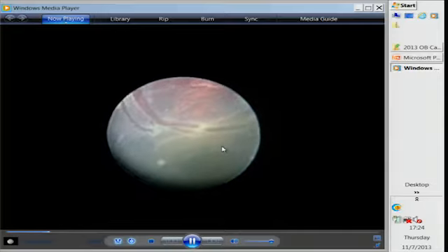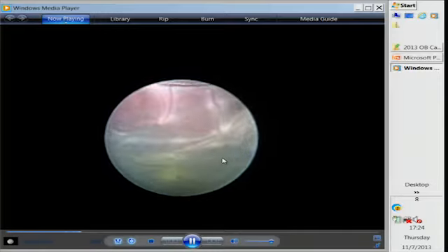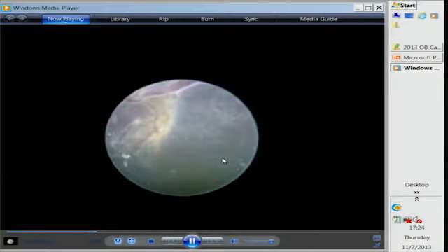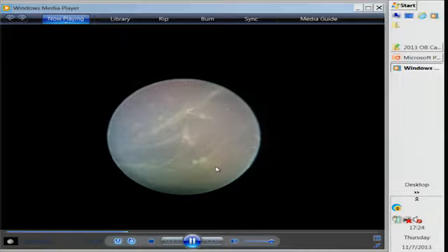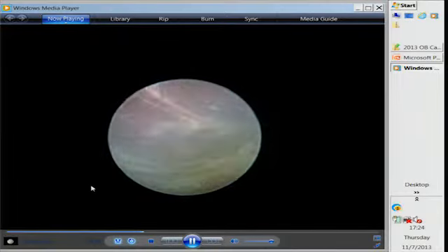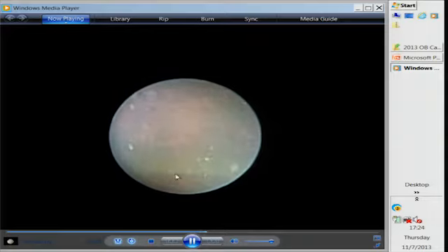This is when they first start. We're looking at the vessels. Here's the bigger baby, that's baby A. Coming back in. There's the smaller baby. And see, there's the amnion being pushed right against that baby. That baby's kind of pushed way over to the side.